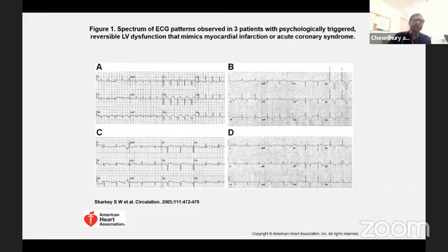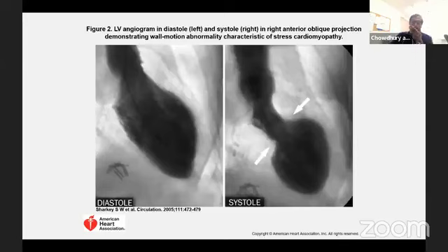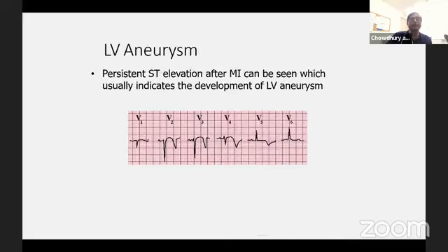And that's why it is very important that we as a group should actually promote bedside ultrasound to get an idea about what is going on with the LV function and whether there is any morphologic sign of apical ballooning or, for that matter, stress cardiomyopathy. We published this, that echo can be helpful. And in COVID time, we actually avoided many patients going to the cath lab.